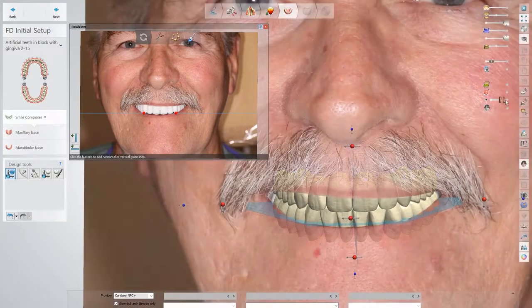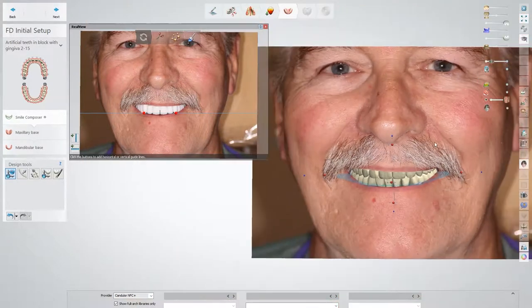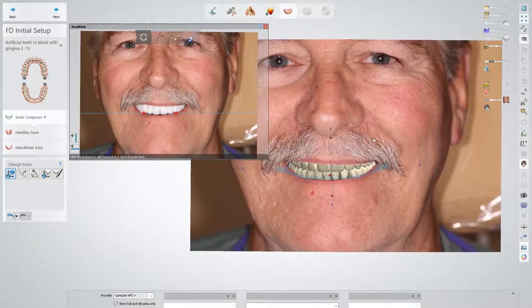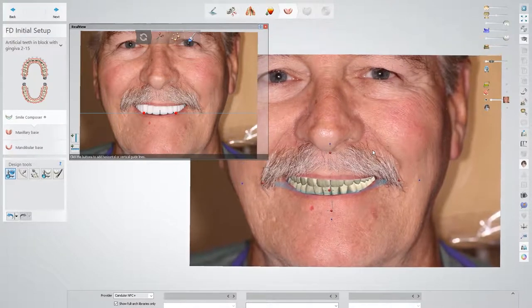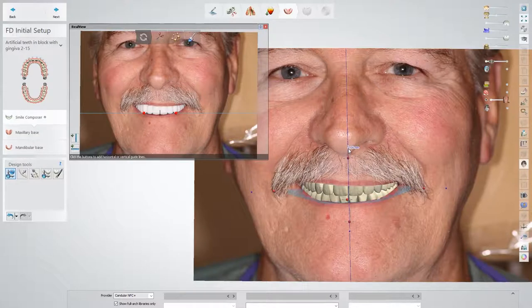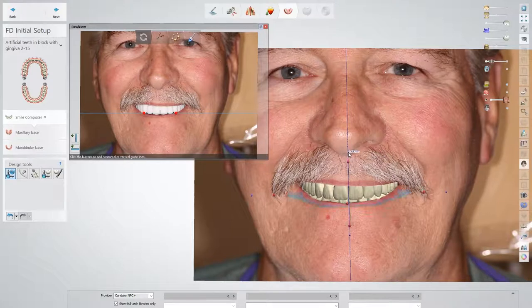Once we're able to properly align the photo with the design from the previous try-in, we can then start to make some changes. This patient at try-in is showing a lot more tooth than they're accustomed to with their present denture, so with this tool we're able to go in and bring the incisal edge up so that we don't have as much tooth display for this patient.